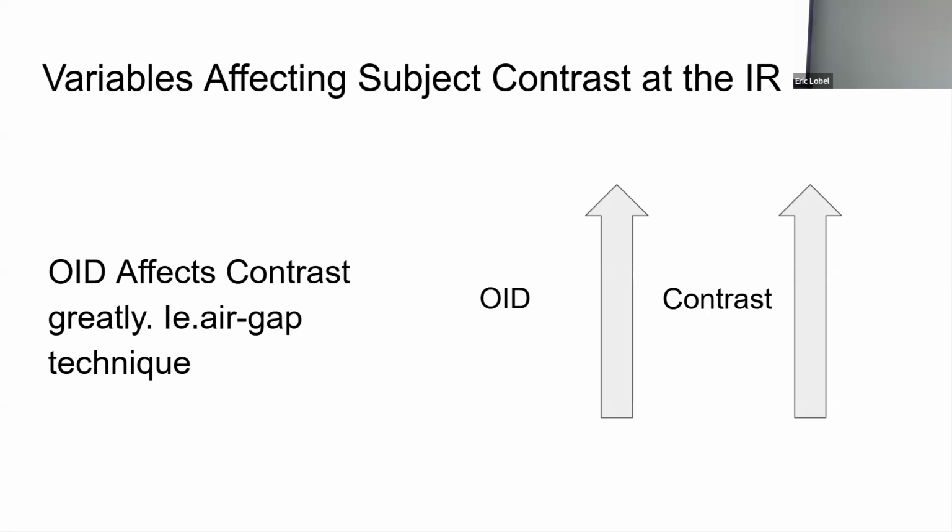So what I think you do in real life is when you say X-ray, that's your signal, and everyone leaves and you take your time and do what you need to do. You don't rush through it. Right. Don't take all day because people have to do stuff. Right. But that's your signal. Not that we got behind in the lab in terms of time, so in a way, I'm glad it happens somewhat this way. But in reality, you had a lot of time to say X-ray and then figure out what you have to do.